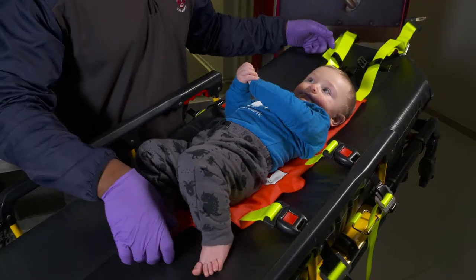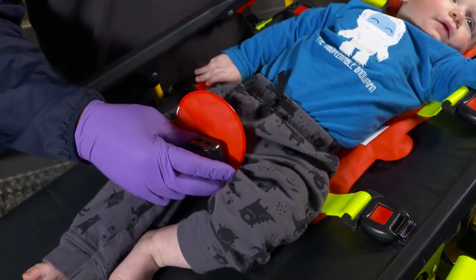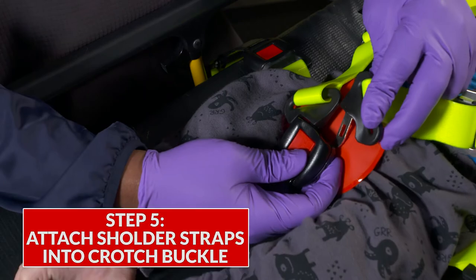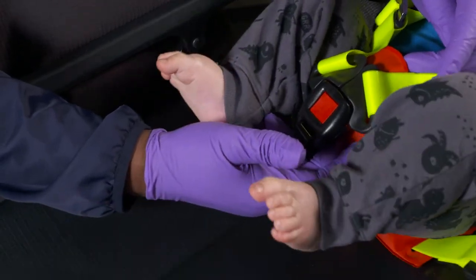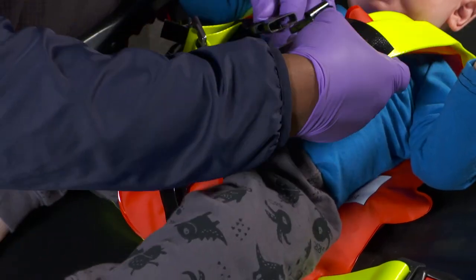Position the child onto the harness and bring the shoulder straps over the torso. Now bring the crotch buckle between the legs to meet the shoulder straps. Attach the shoulder straps into the crotch buckle and tug on the shoulder straps to tighten. Then click in the chest strap between each shoulder strap.